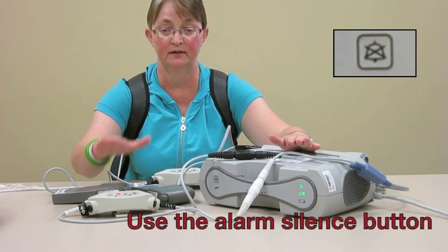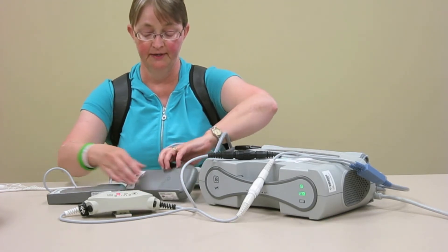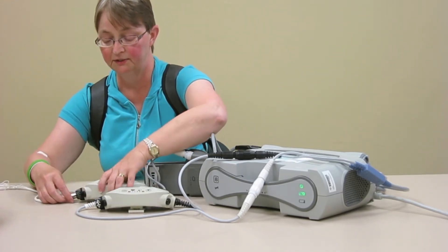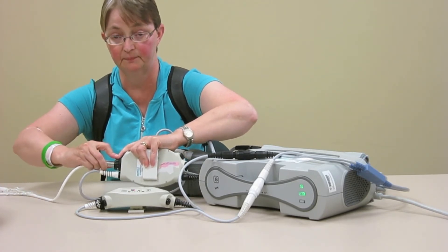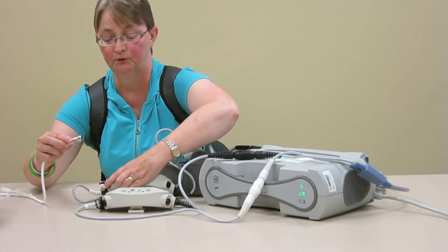Silence the alarm, and that should give you a little less anxiety while you're switching. The next thing we need to do is get them in line. We're going to disconnect from this one, switch the lock off, push the button in so the two arrows are in line. Push the buttons in and open it.